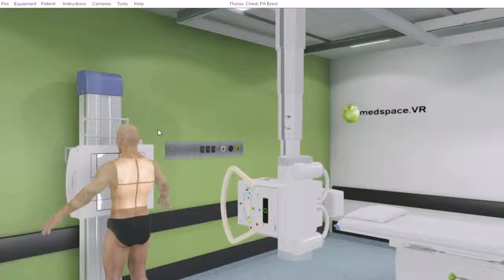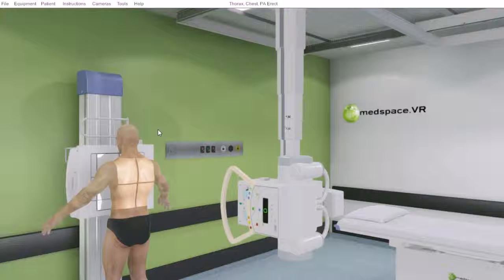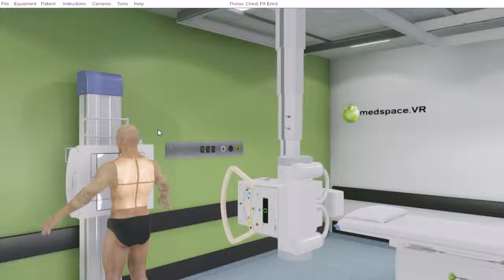In this tutorial we will be covering an introduction to the Medspace XR environment. Medspace XR is a virtual reality x-ray room where students can safely practice the process of performing radiographic projections.